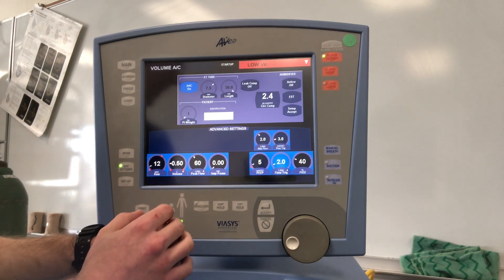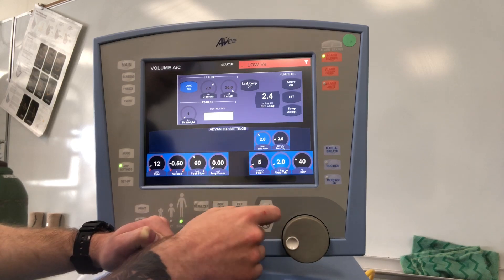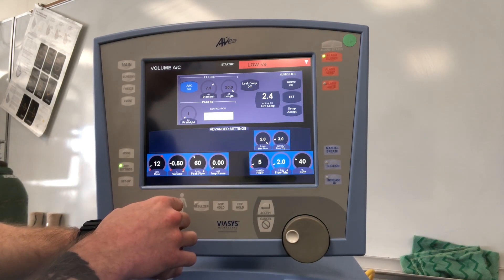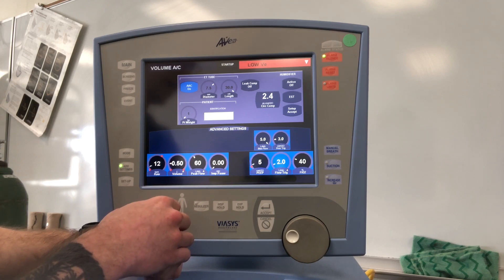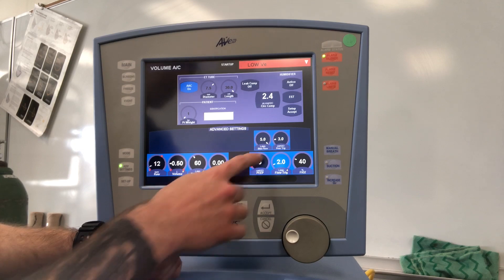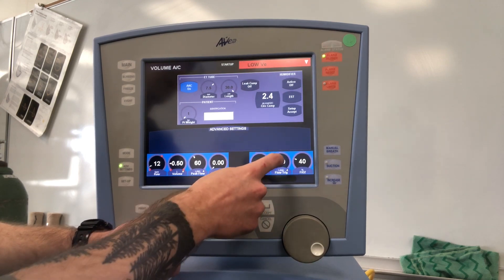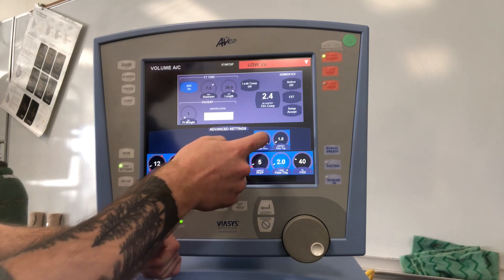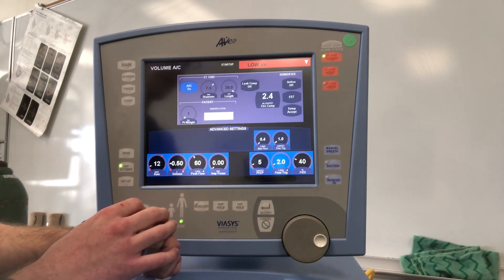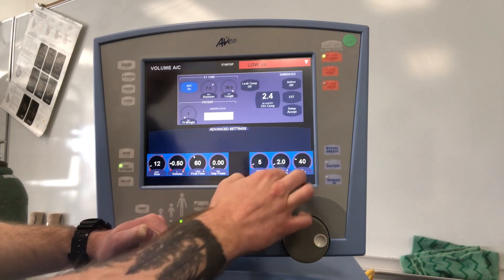The Avea has two different trigger criteria. First, bias flow — bias flow needs to be at or above your actual flow trigger. We recommend keeping it around five. When giving nebulizers, turn your bias flow down to stop wasting medication as it goes through the circuit. Flow trigger: recommend two. Pressure trigger: one. When you turn off bias flow for nebulized medication, it switches the patient from a flow trigger to a pressure trigger, so watch the patient initially to ensure they're doing okay.